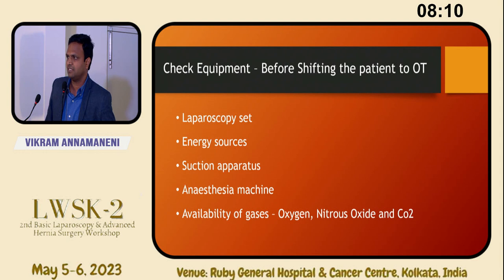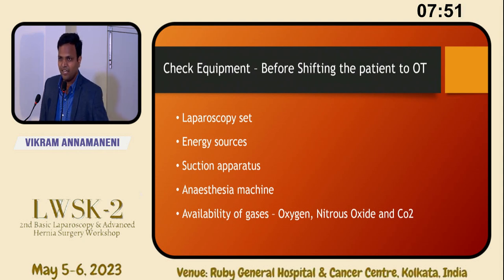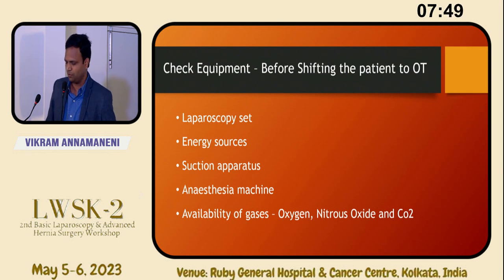And check the anesthesia machine also. We should learn to check the anesthesia machine, because anesthetists change, and different people will come on different occasions. I had difficulty once. And you should check the availability of gases also. In a corporate setup, we don't mind about availability. When I come in and operate in the morning, I never ask whether there is oxygen, nitrous oxide, or carbon dioxide. No need to ask there. But in a small setup, you should check the level and backup of these three gases if you want to do a laparoscopy.